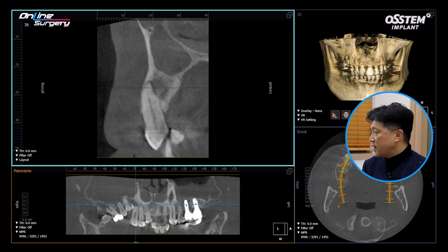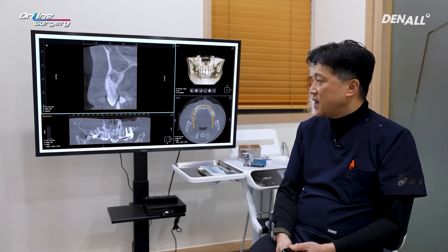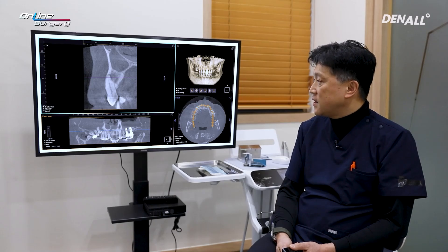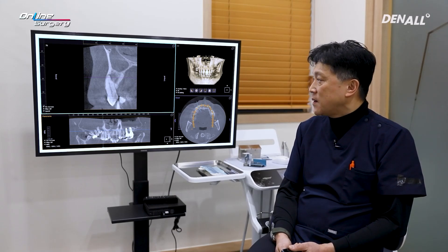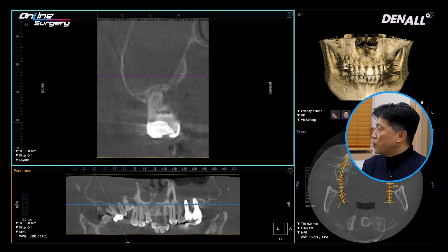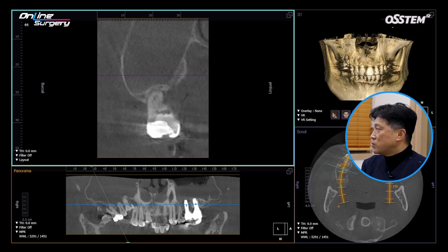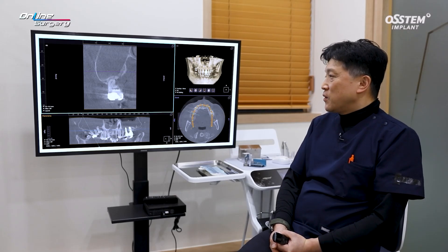In the left sinus, there's a bit of an air bubble. Rather than the tooth problem itself, I don't think the calculus caused the haziness in the sinus. Naturally, you could assume there would be a huge defect if all these teeth were to be removed. Looking at the CT, this is the situation — this is the premolar — and you can see the teeth beyond the molar area. The sinus lateral wall is extremely thin, and the vertical bone height was about 1 mm. In other words, this is a very difficult case.